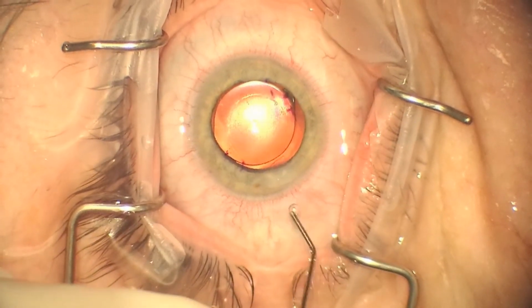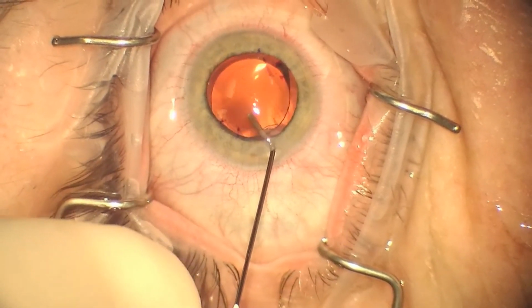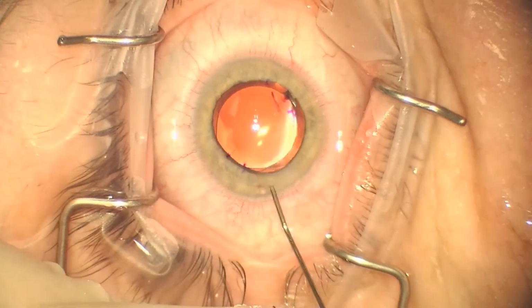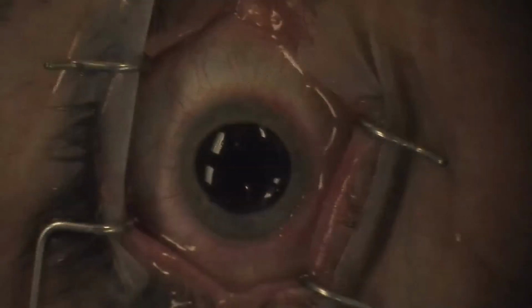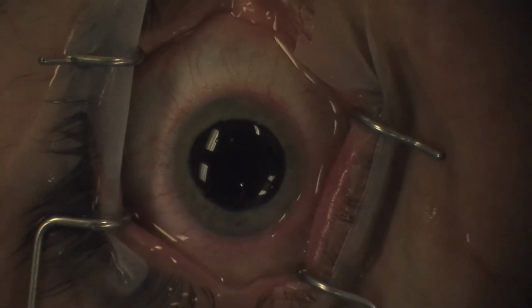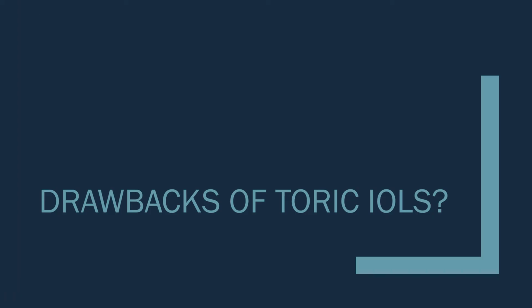The IOL is repositioned so that it is covered by the capsular rhexis, and a repeat ORA is performed, confirming that there is now about 1/2 a diopter of residual astigmatism remaining. So that draws to an end the toric IOL process.